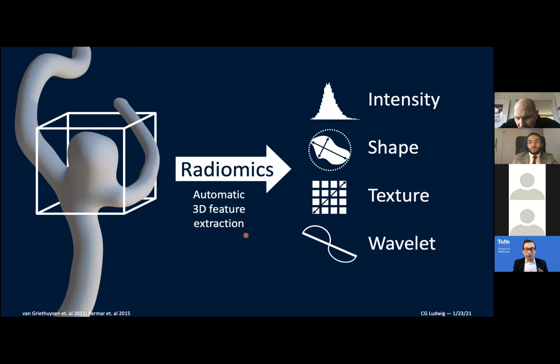So today, my goal here was to evaluate how well these automatic radiomics features predict the rupture status of cerebral aneurysms. Can I extract some features, the radiomics features from these cerebral aneurysms, and use those to tell if that aneurysm is ruptured or not?